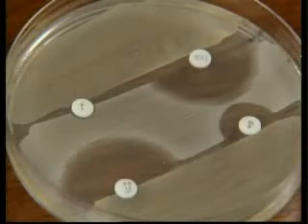The importance of this test for antimicrobial sensitivity is that it is a controlled sensitivity test. You can be assured that if the test bacterium grows up to an antibiotic disc, that strain is resistant to that antimicrobial agent. This is because antibiotic from the disc will have inhibited the control strain. If the control strain also grows up to the disc, this shows that the disc didn't contain active antibiotic for some reason. In such cases, the susceptibility test needs to be repeated for the antibiotic that didn't work properly.